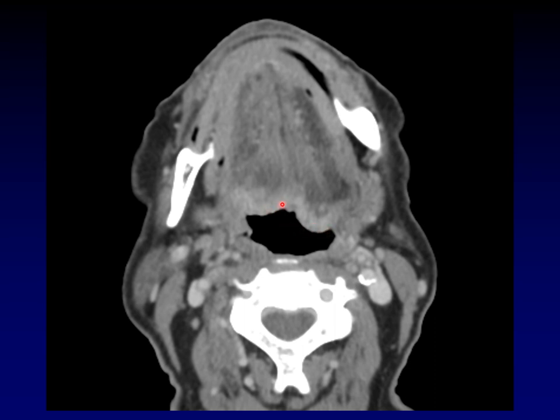Instead, what we're seeing is more like displacement of the tongue base — laxity of the tongue base. It's falling back with gravity. And then when we look at the tongue itself, we see that there is denervation atrophy throughout this side of the tongue — too much fat relative to the more muscular tongue on the other side. Denervation atrophy, laxity of the tongue base — all of this points to cranial nerve 12.